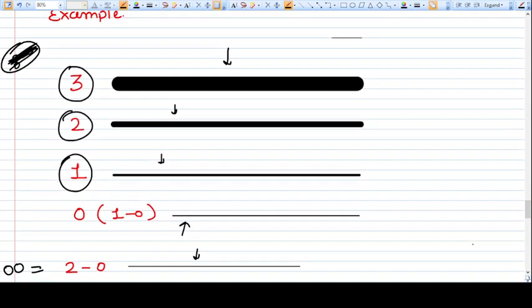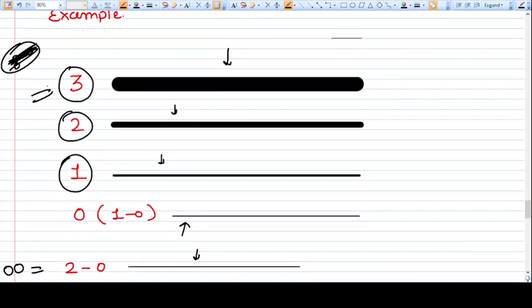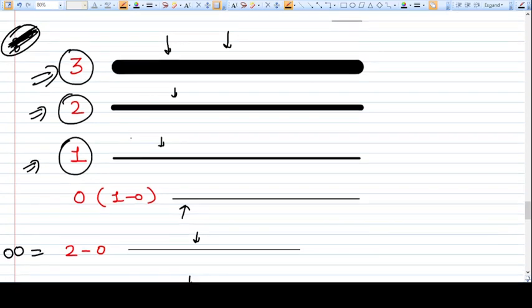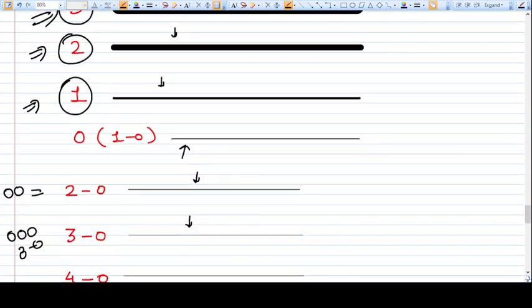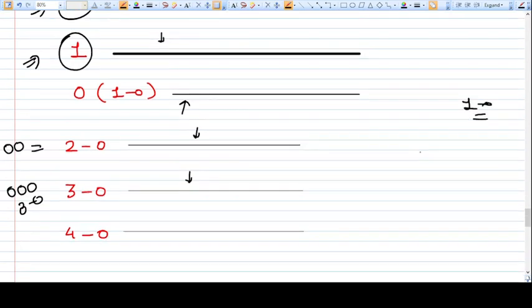Here is an example. Number three suture may look like this. Number two suture is thinner and may look like this. Number one suture may look like this. Now zero number suture may look like this — and zero is also called one-zero. Further, two-zero, three-zero, and four-zero will be more and more thinner.